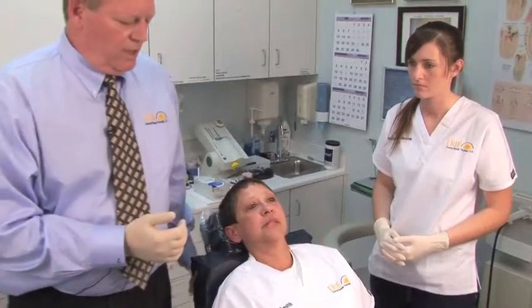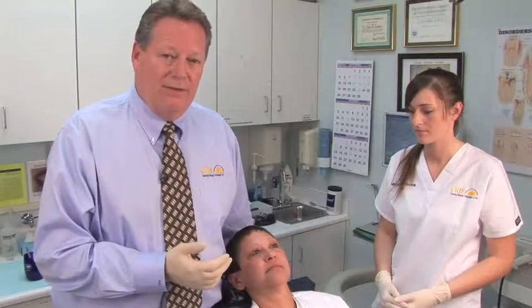We're going to instruct the patient that in the morning when they remove their appliance, as soon as they remove it, they're to use the bite exerciser. Have them place the bite exerciser on their lower front teeth, close their lower jaw until their upper jaw hits, and squeeze together. We're asking the patients to wear this for approximately five minutes. It helps to deprogram all the muscles and reseat the joint.